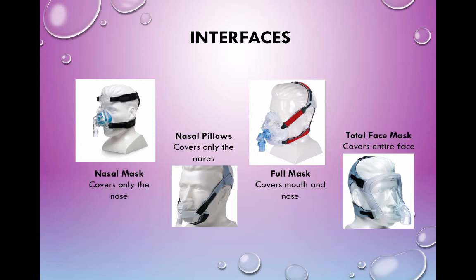One of the newer masks, and we actually just got these in for our pediatric population in the ED, so if anyone's in the ED, you may see these soon, is basically called a scuba, and it covers everything: the eyes, the nose, the mouth. The idea behind it is you can see past it. It's supposedly a little bit more receptive for patients. I've tried them in the past with adults, and they hated it.